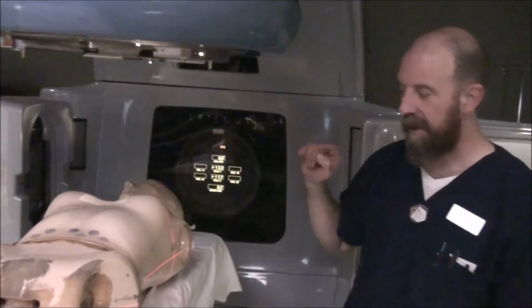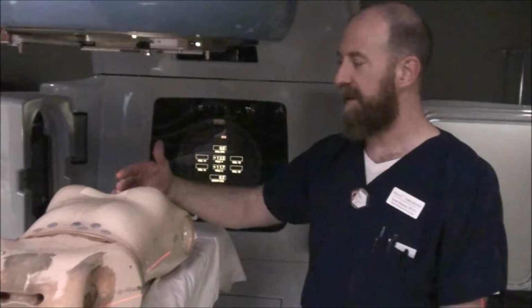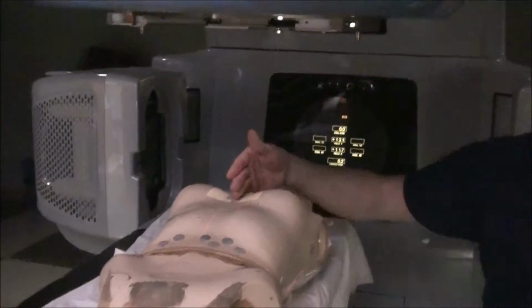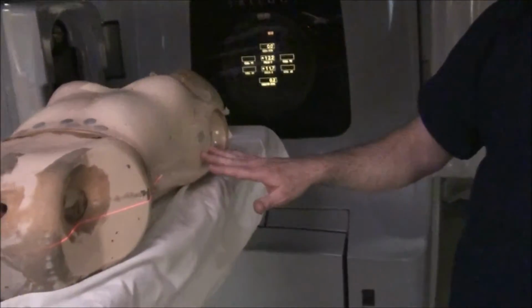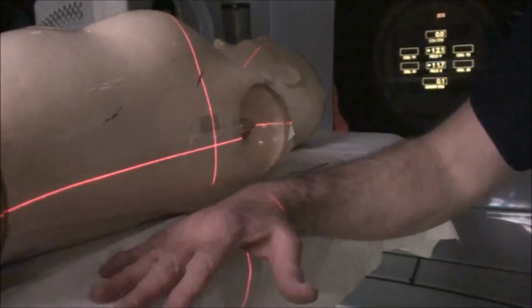So, having said that, we do know that our entry and exit points are something like this. The entry point is usually going to be mid-sternum. The entry exit point from the lateral is going to be down the mid-axillary line. That's kind of where I have the lasers.